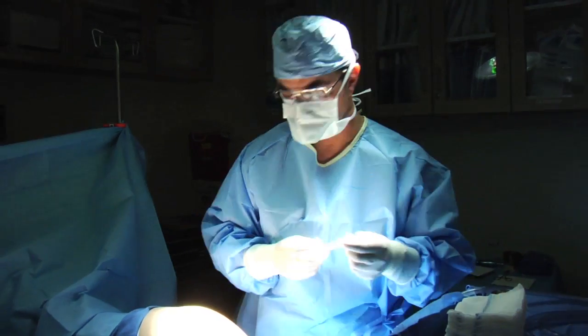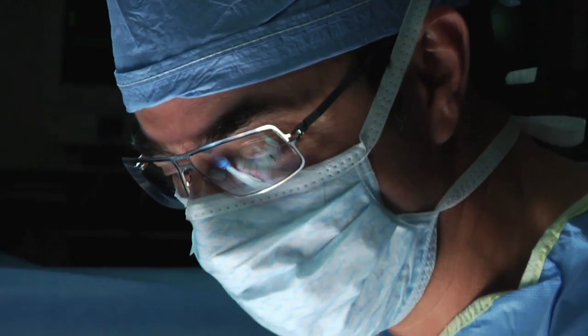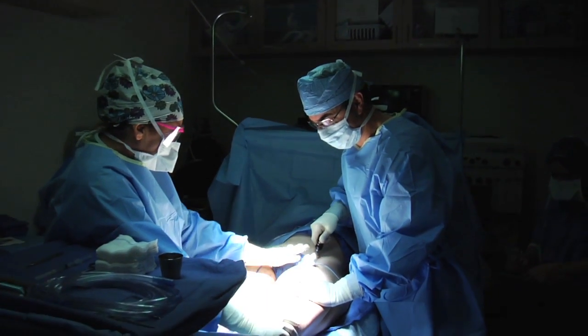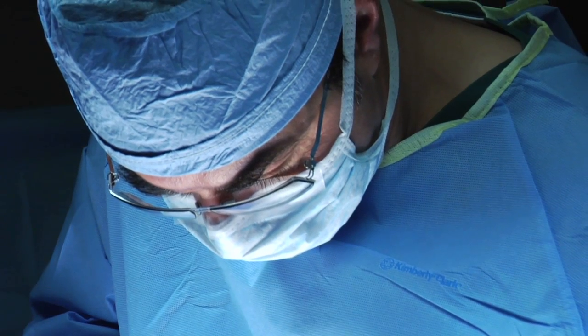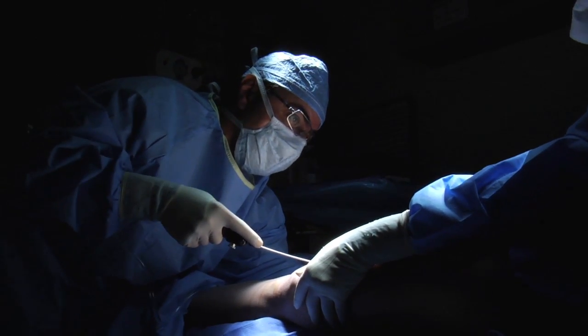In terms of Jacqueline's surgery, the whole surgery itself, including the mini liposuction and the fat transfer, was about 1 hour and 15 minutes. It's a fairly quick surgery. The first part of it is putting the numbing fluid in, the way I properly numb the area up, but it also hydrodissects the fatty tissue to get a much more pure fat removal for no bleeding and bruising. That took about 15 minutes to do. She felt a little pinching as the fluid was going in. I'm very skilled in terms of how I sneak that fluid in with very little discomfort.